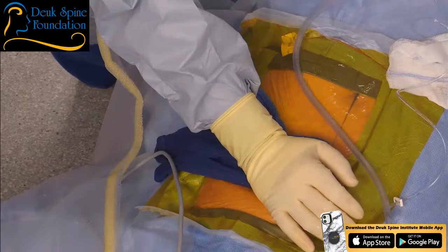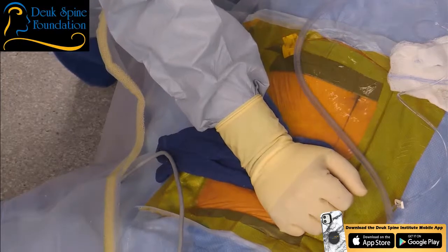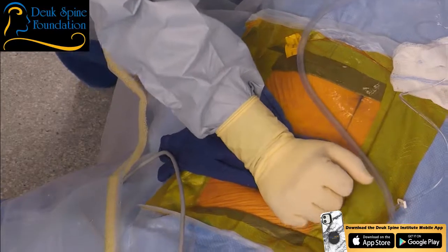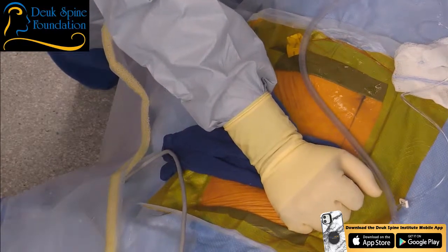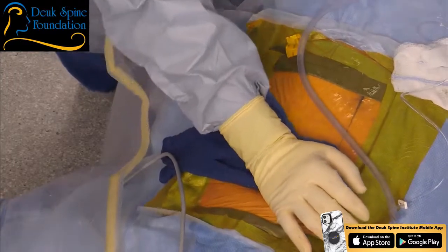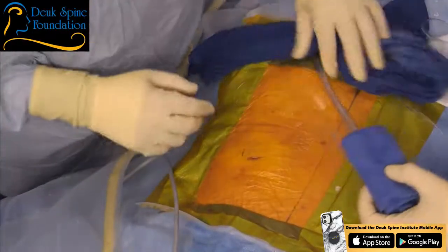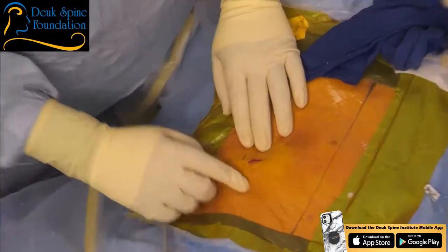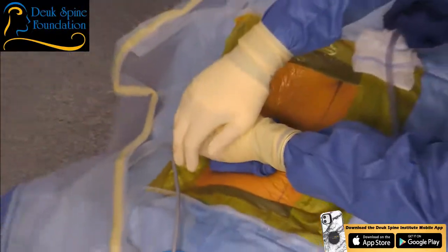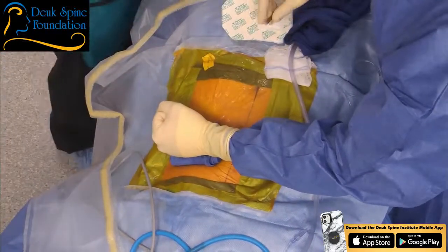So basically, the annular tear today was whiter optically to our eyes because very little of the nuclear material stained, because the stain did not have access to the nuclear material within the tear since it was so scarred up. So the key is the scar tissue. Great question, great observation. All right, here is the incision. The whole surgery was done through this tiny little cut, and our patient will go home in about 30 to 45 minutes. And he was comfortable during the procedure, which is a blessing.